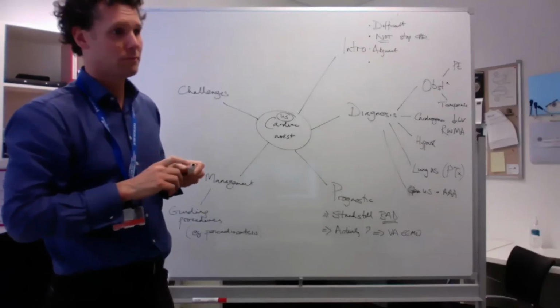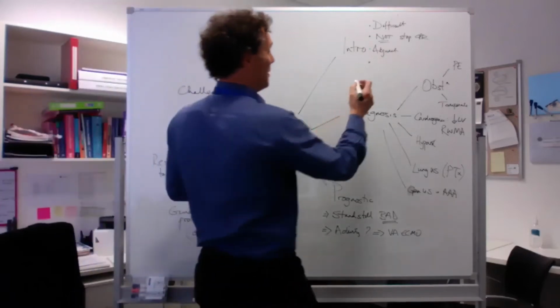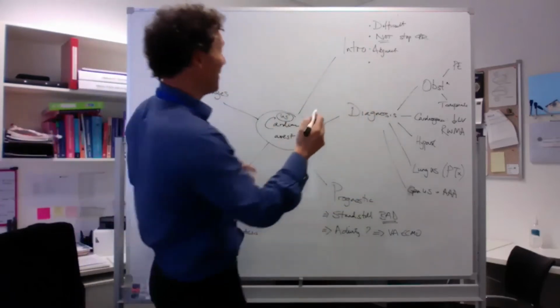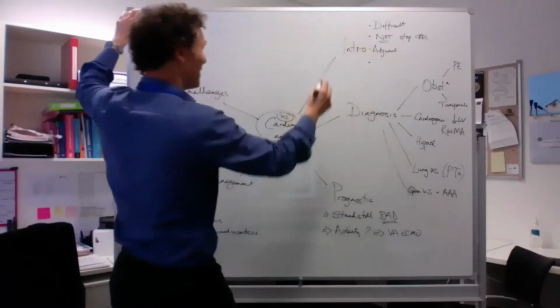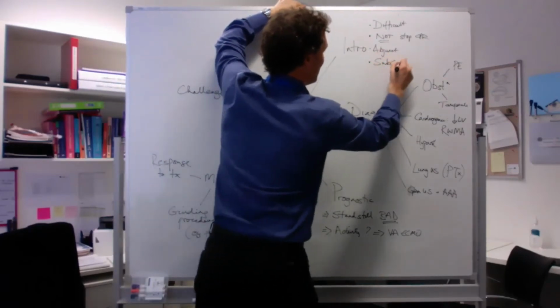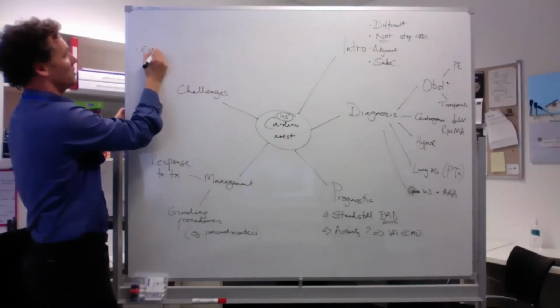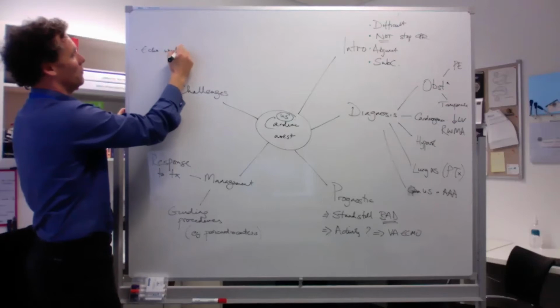Well, you can't do a parasternal long or short. No, so you have to do an apical. Or down the esophagus. So the esophagus, fantastic. I'd say here you've got the challenge of doing it. It's only subcostal. The challenges are, echo windows are tricky. You've got sort of one of them.